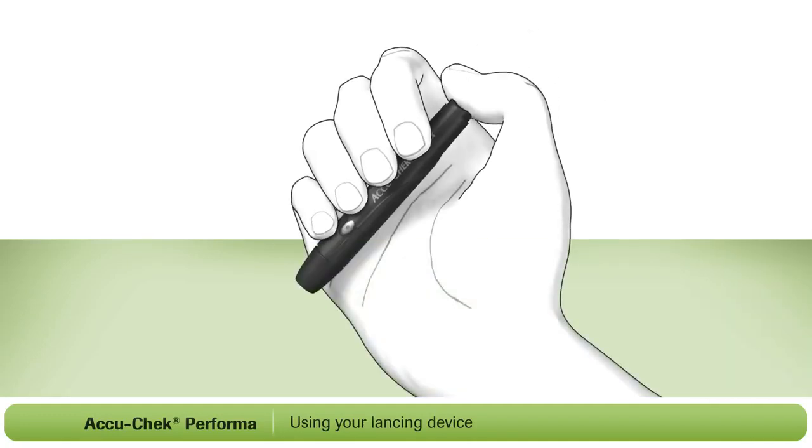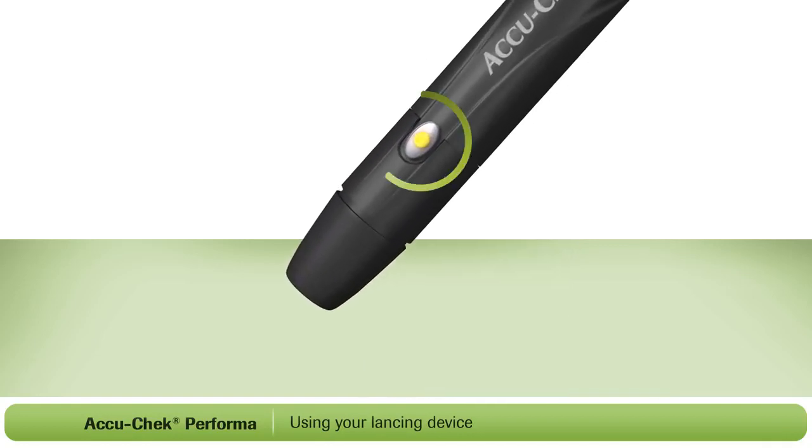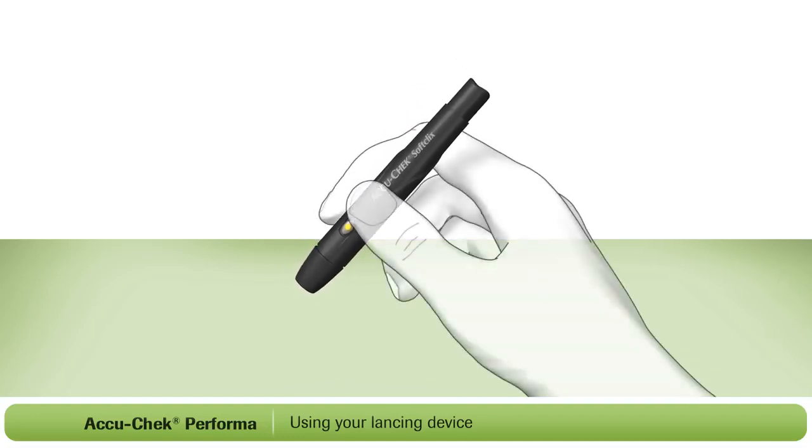Press the plunger all the way down. The release button on the side of the lancing device has now turned yellow. This indicates that your lancing device is now primed and ready to use. Press the yellow button to release the lancet. This will lance your finger.